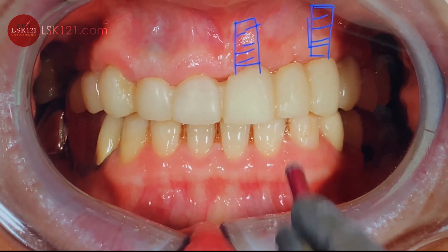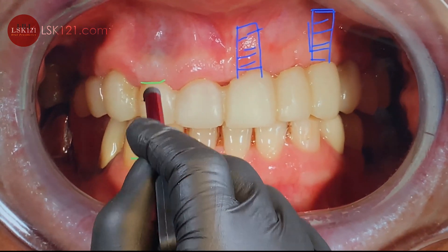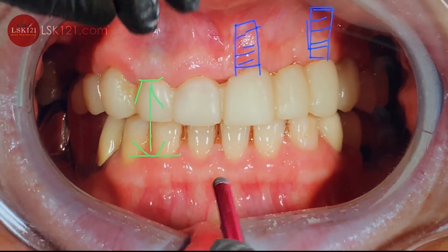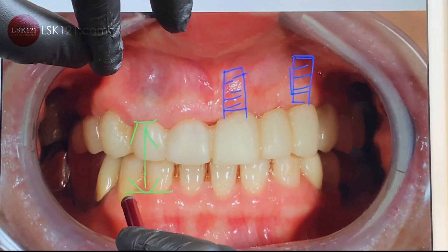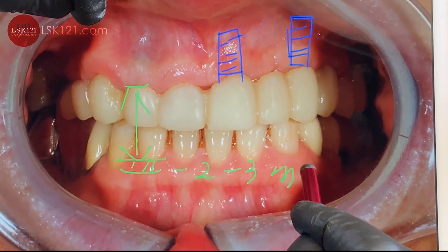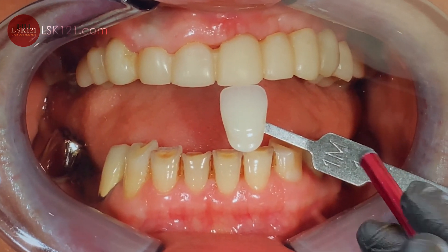Before we proceed, we have to address the vertical dimension, which is too low. We have to increase it — open the bite — and increase it at least two to three millimeters. The doctor and patient communicated about this, and it's now wide open.